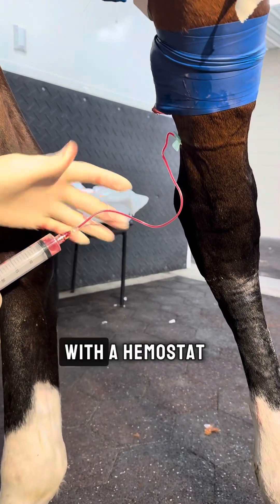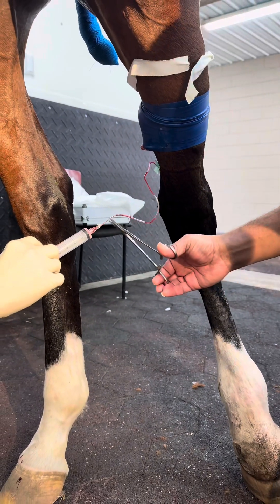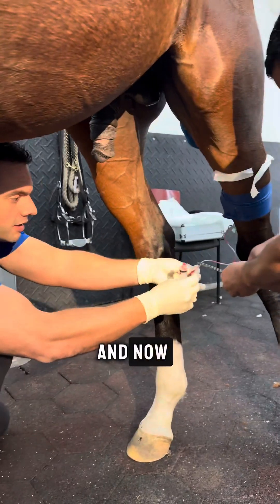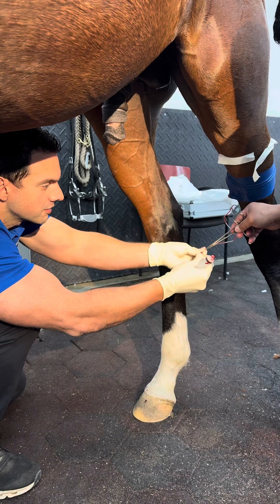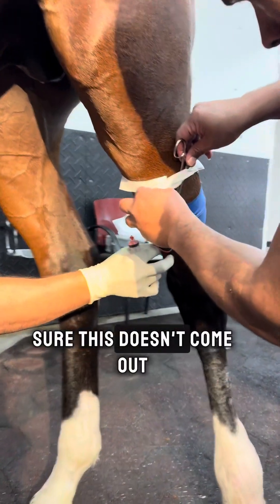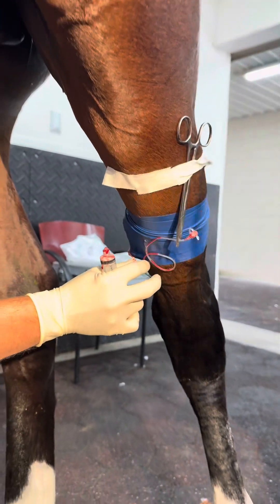Now my assistant is going to clamp it with the hemostat. It's going to go right there — I'm going to make sure this doesn't come out. Perfect.